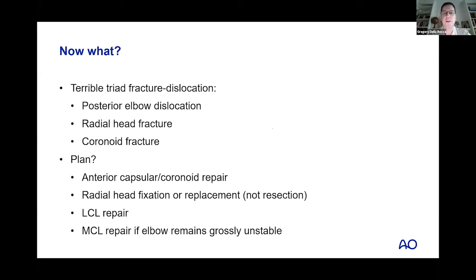So if you mark your lateral epicondyle and you mark 10 centimeters distal on the skin, distal to the olecranon tip on the subcutaneous border of the ulna, and draw a line in between there, that's where your incision can go. That's sitting right over Kocher's interval. And you can just keep dissecting a little bit further distal until you get to a point where you feel like you've actually identified a plane. And then you can just go ahead and incise that plane back towards the epicondyle.